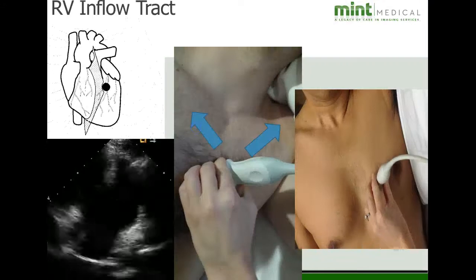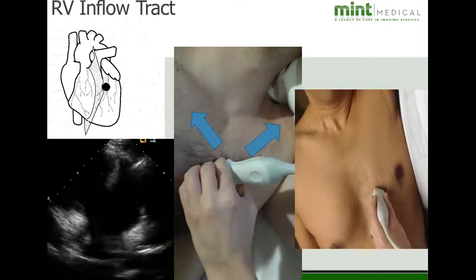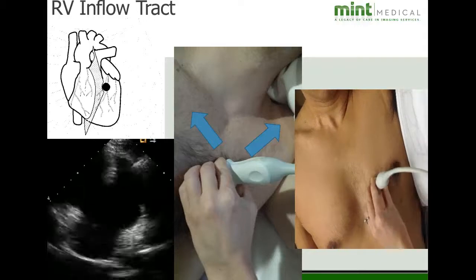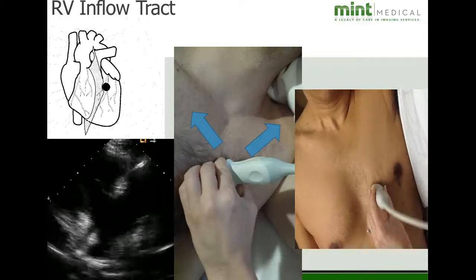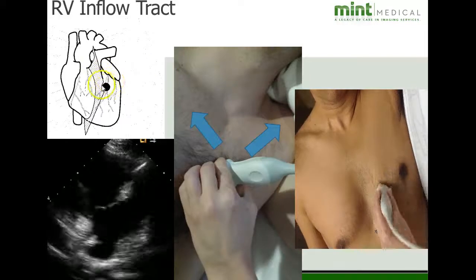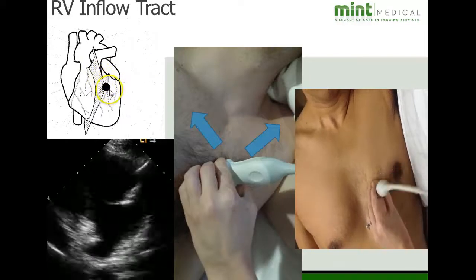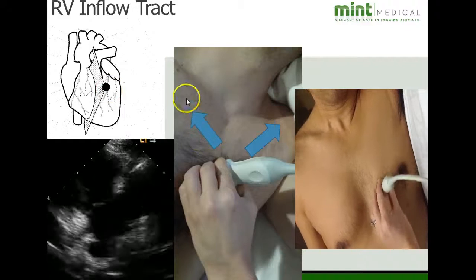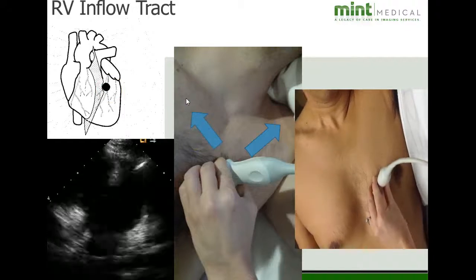The next imaging view from the parasternal long axis will be the right ventricular inflow tract view. This view, once again, will be slicing from the parasternal long axis imaging. Your indicator will remain in the same position, facing towards the patient's right shoulder.